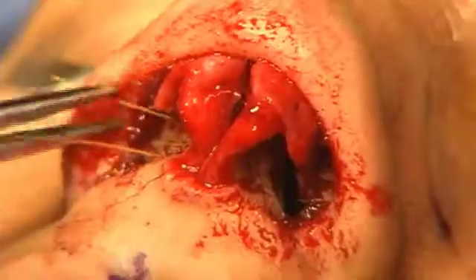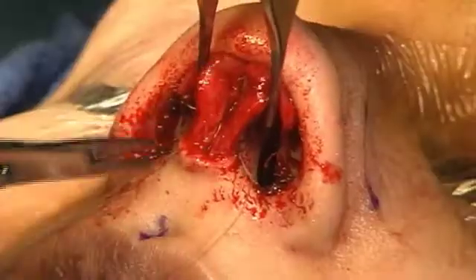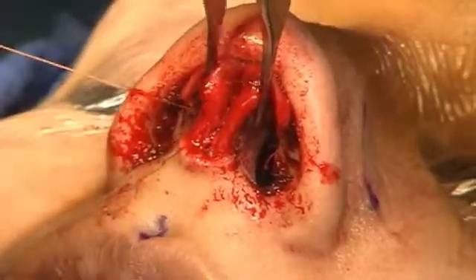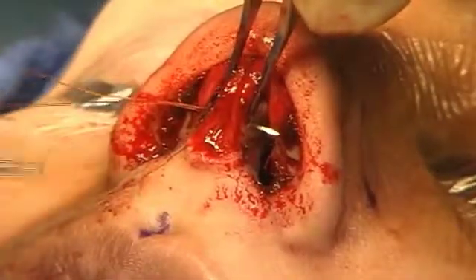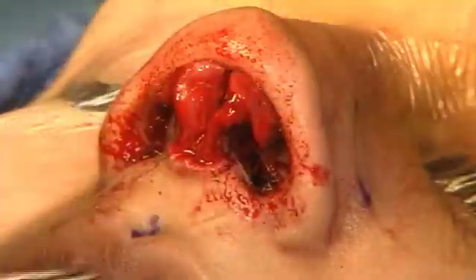A tongue and groove fixation of the medial and intermediate crura onto the caudal replacement graft is now being executed. These 4-0 plain gut sutures were reinforced with nylon intracrurial sutures.